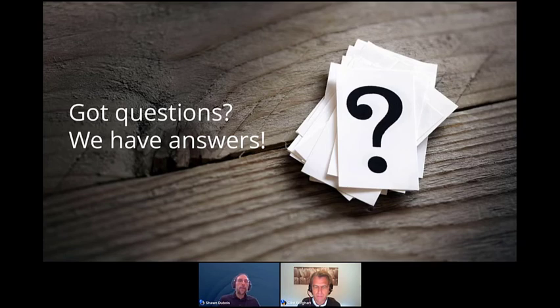Yes, it does. So when we talk about the Quanti-Tray, I mentioned it was 51 well. If you look at the tray, there's one size of well and there's 50 of those total. So the 51st well is actually that large well at the top, that rectangle well at the top. And the same thing with the Quanti-Tray 2000. There's the 48 small wells, they're all the same size at the bottom.